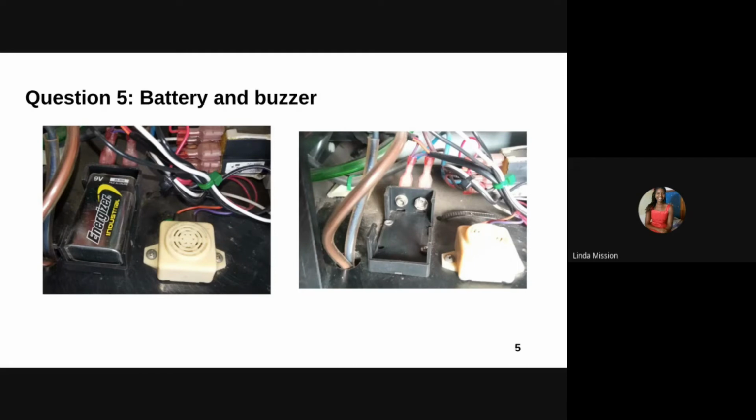So you have to check the wires that connect the battery terminals and the buzzer and make sure that they are securely fastened, and also ensure that there is no rusting on the terminals of the battery. And if you found out that the battery is drained, you have to replace it with a new battery. And also make sure that when pressing the new battery, there shouldn't be loose connections. And also ensure that you maintain the proper polarity of the battery and the connectors.